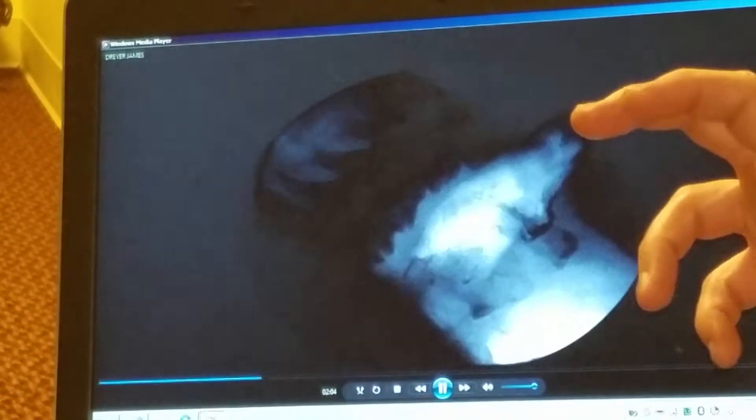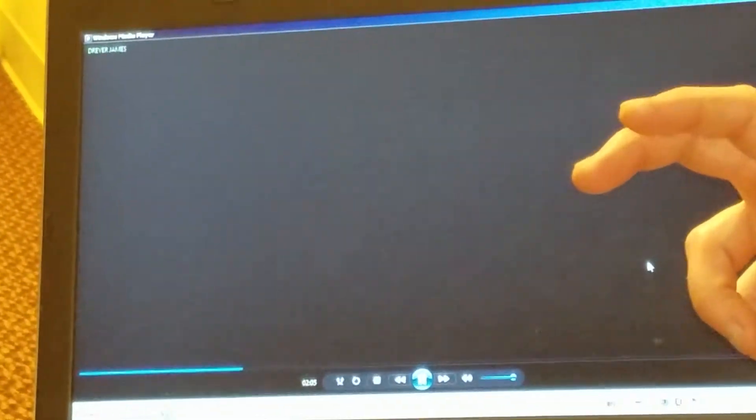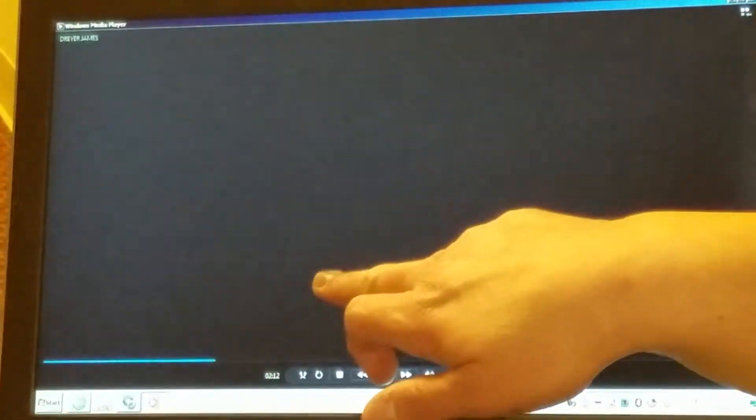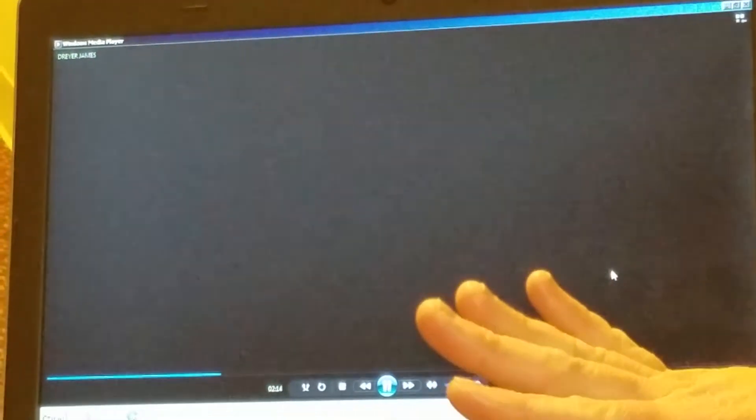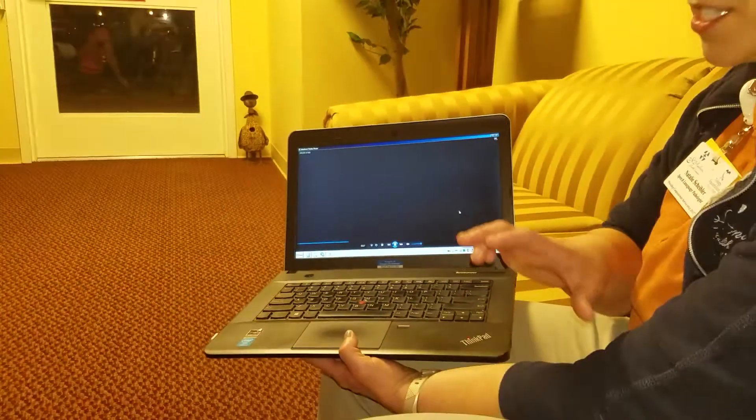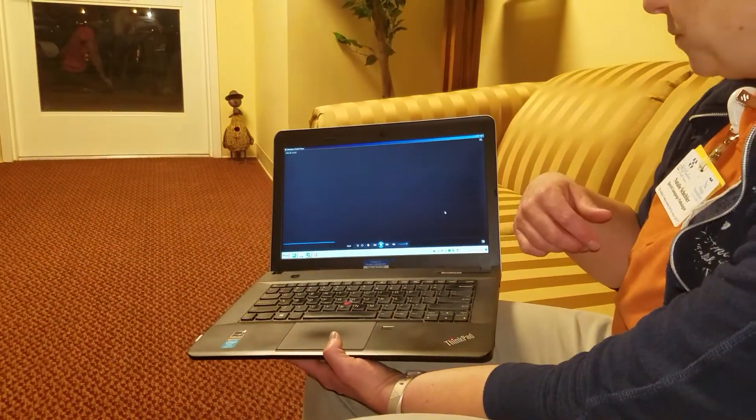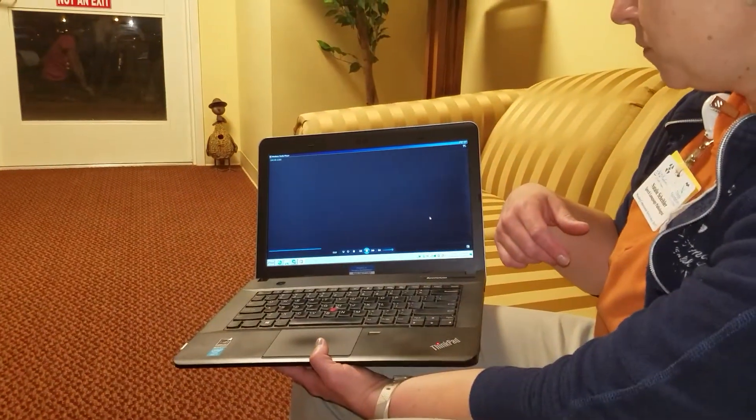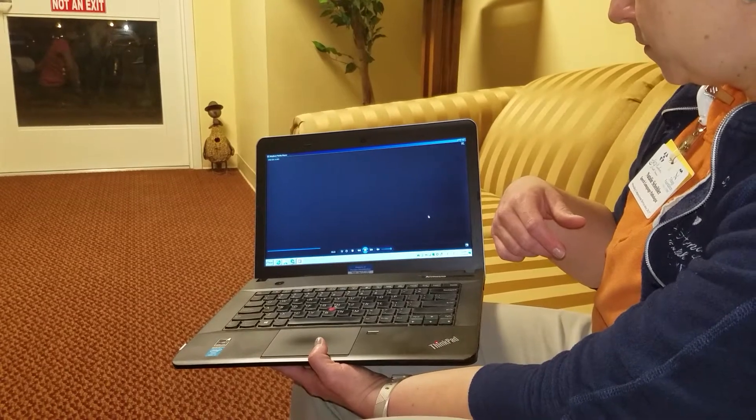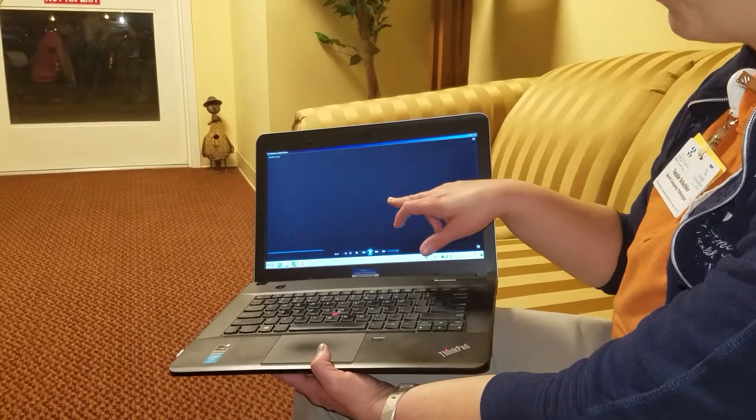That's the thicker, so we had a little bit more hanging out in here. That could be why he was coughing a little bit last week and over the weekend. He had a lot of residue. Thicker's not always better. He had a little bit more residue in there, so thin's definitely the way to go. We just want to do small sips, that's the key.